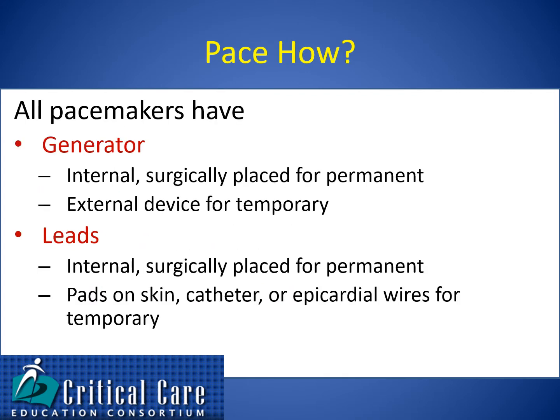So how do we pace patients? All pacers have two components.